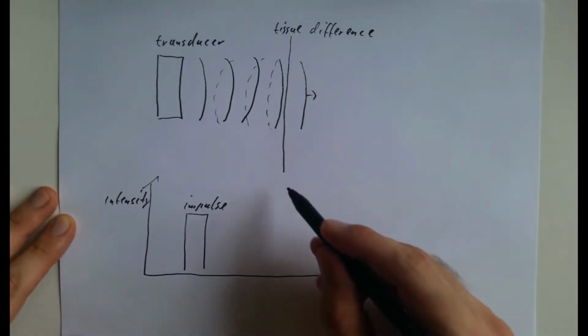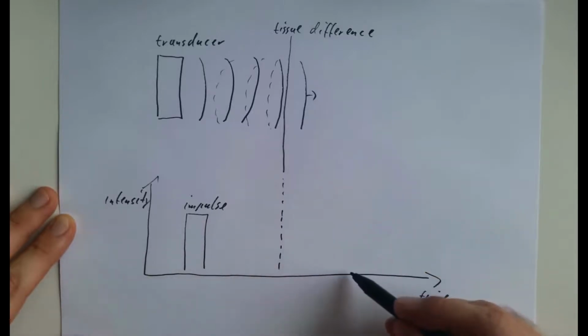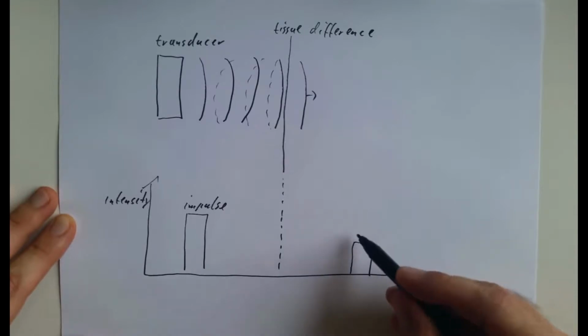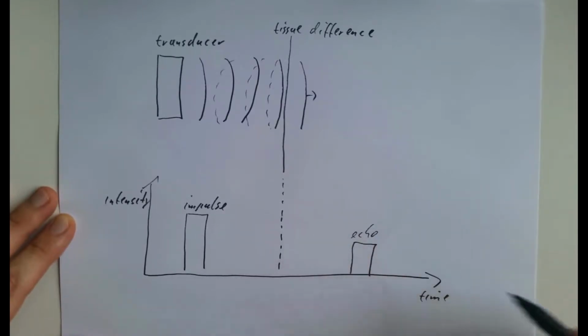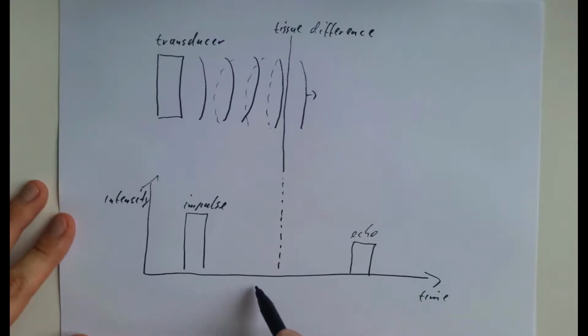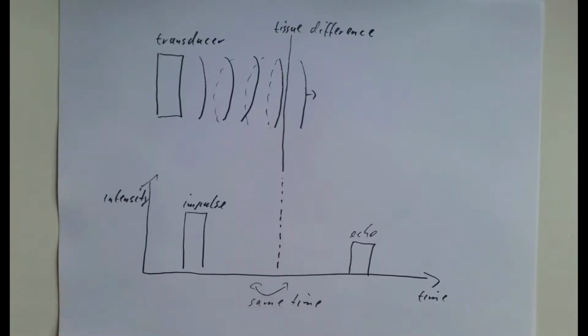The higher the density of tissue, the higher the reflection. And on the basis of the running times, in this graph, images get created, okay? Images, right? Not quite. We speak about ultrasound, that means we speak about sonograms.